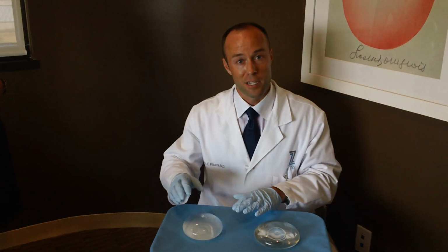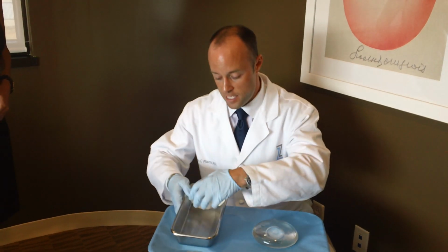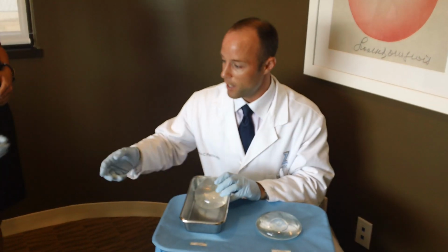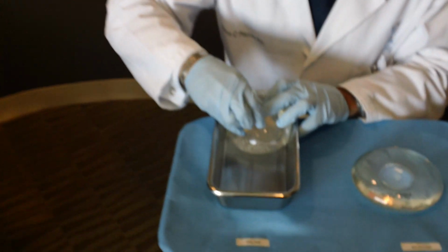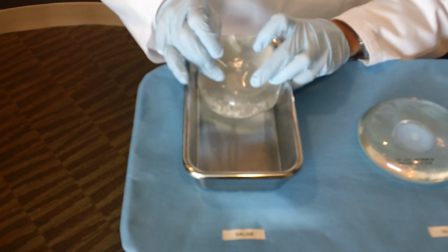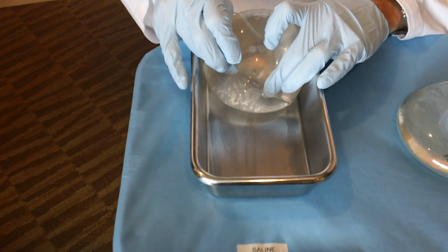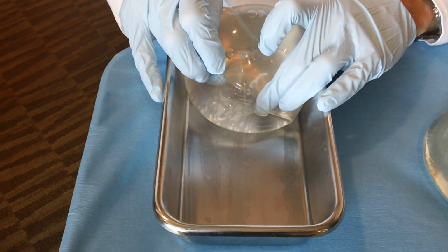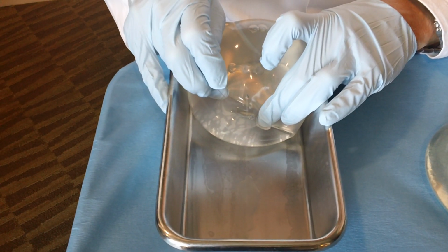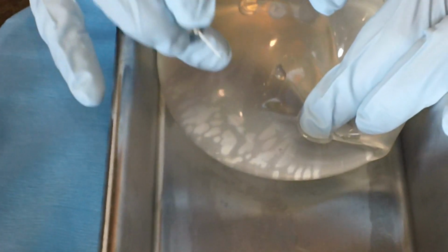Now, what I'm going to do is show you what it looks like when we have a hole in this implant. Typically, if this implant was to deflate, take a needle. If this implant was to deflate, what we would notice is that it would slowly start to drip a little bit of saline. You can see here we have a little drop of saline, and I'm pushing on the implant to demonstrate that it was a slow leak. Now, this could happen over several days to even weeks, and some patients may actually wake up and have a completely flat breast or loss of significant breast volume.